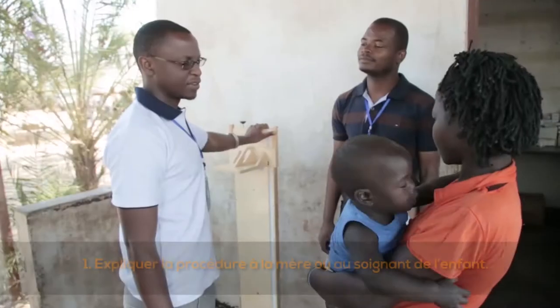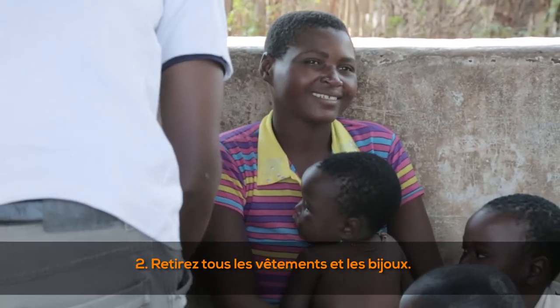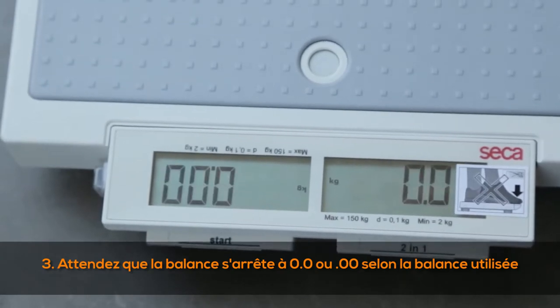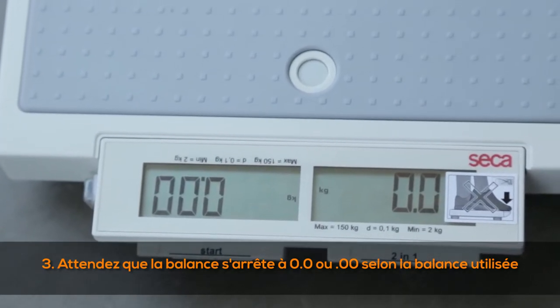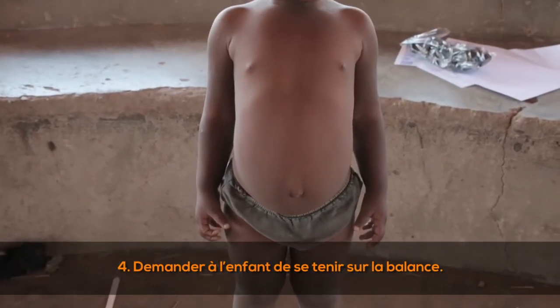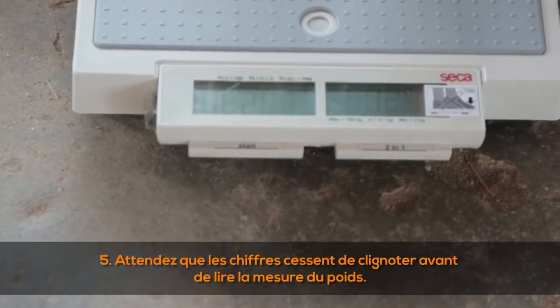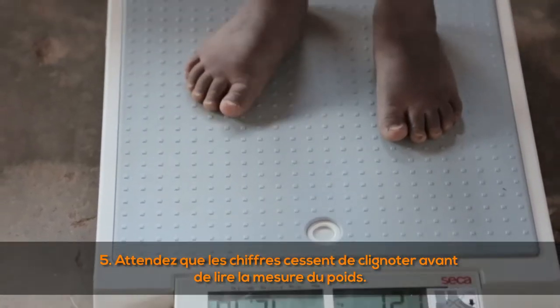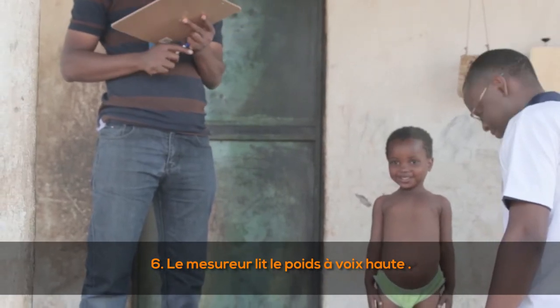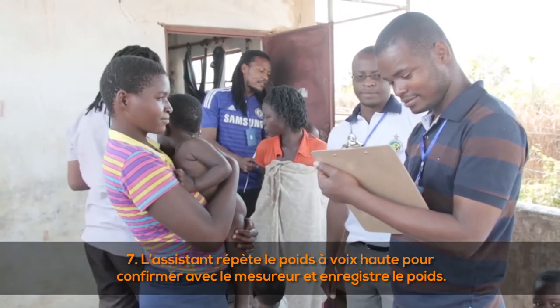For direct weighing: (1) explain the procedure to the mother or caregiver; (2) remove all clothing and jewelry; (3) wait for the scale to stop at 0.0 or 0.00 depending on the scale in use; (4) ask the child to stand on the scale; (5) wait until the number stops flashing before reading; (6) the measurer reads the weight out loud; (7) the assistant repeats the weight out loud to confirm and records the weight.